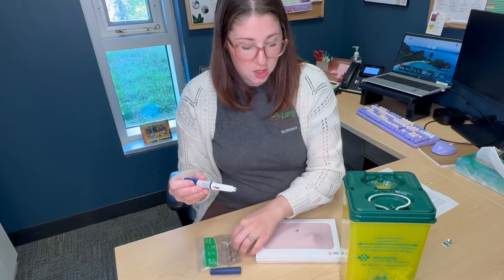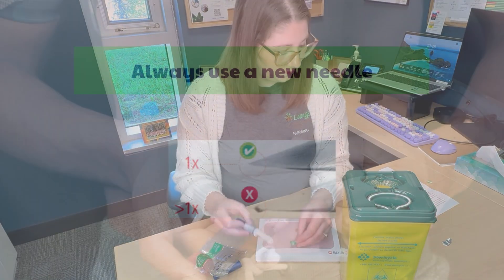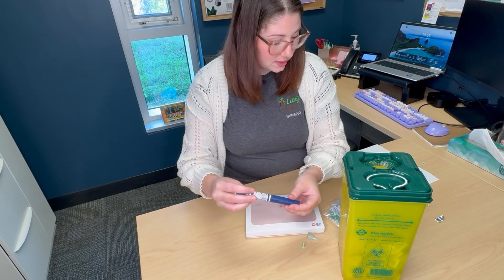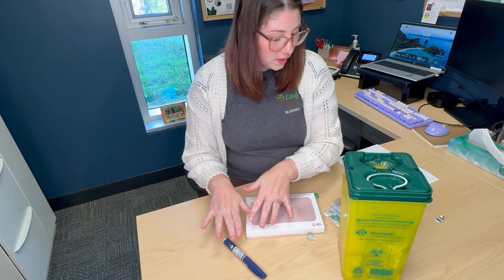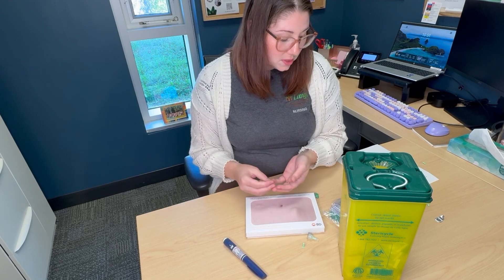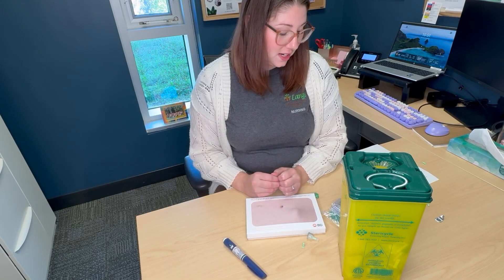Always use a new needle tip each time to promote comfortable and effective injections. Finally, recap your insulin pen and store for future use. You can store all open pens at room temperature and any extra pens in your refrigerator. Most pens can be stored at room temperature for 28 to 30 days safely, with some pens lasting up to 50 days.